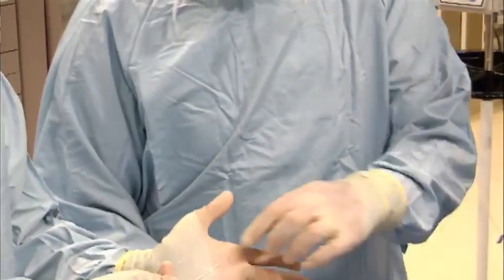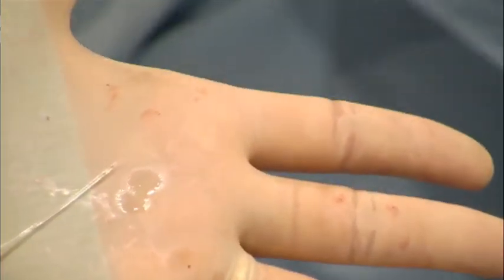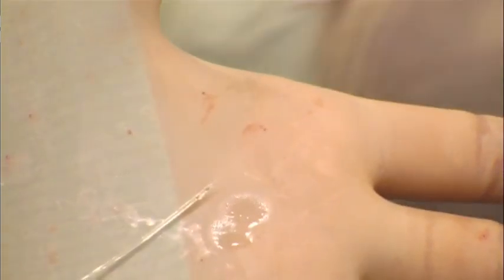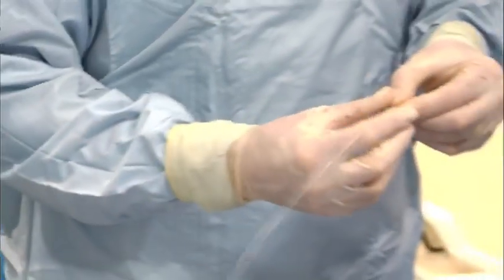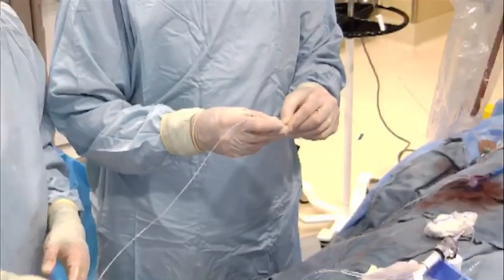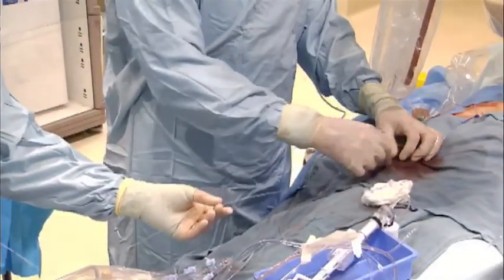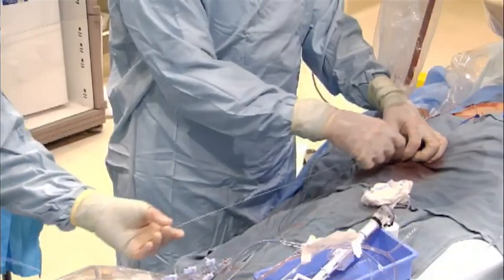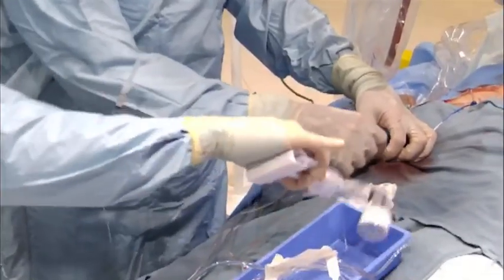You want to focus on the balloon before we put it in? There's just the two dots you're going to see, and there's an extra port proximal and in between the two dots. But by leaving it like this — where we leave it open and let it keep sucking contrast in — Bill, I don't know if you've been doing that, but the preps have been a million times better. So just leave it open with the contrast like that until you get it in the air, and then you can turn it off.